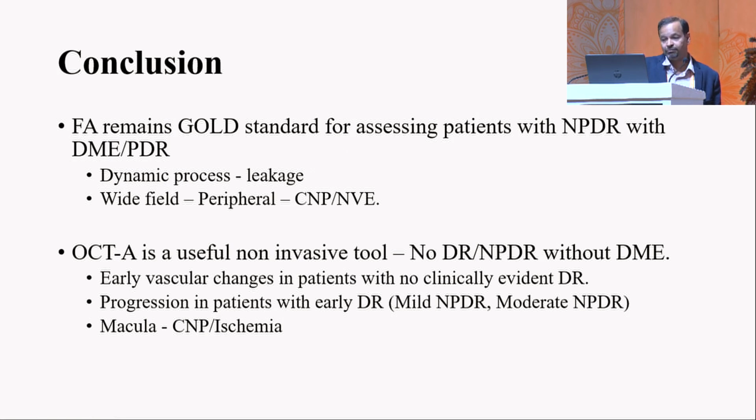It shows some changes even in eyes where there is no clinical diabetic retinopathy. It can be used to monitor progression in patients with diabetic retinopathy and is a very useful indicator of macular ischemia.